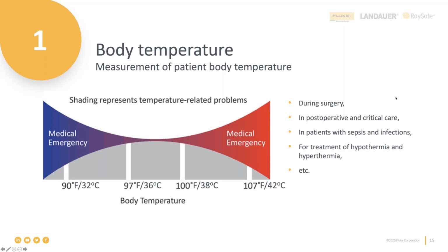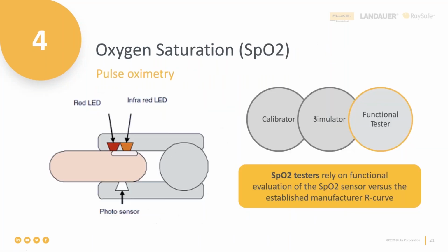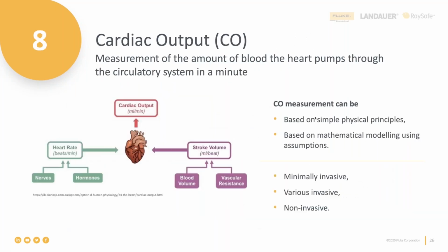And don't forget the other ones, right? The finger thickness, right? The ambient light artifact, right? You're measuring light, so the light in the room can affect it as well. So definitely adjust for those different parameters to ensure that you're having the most complete test program possible.